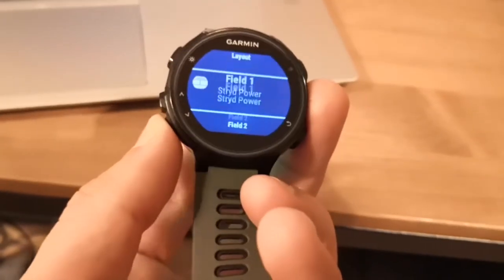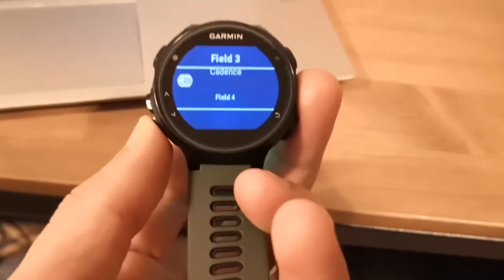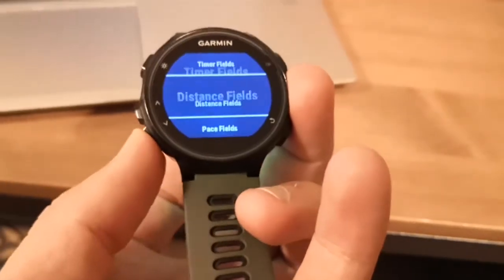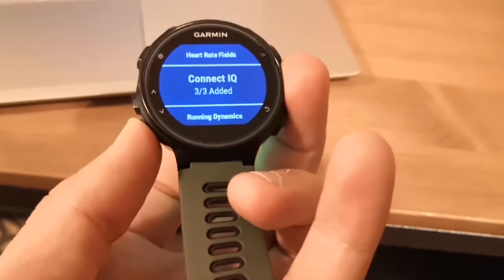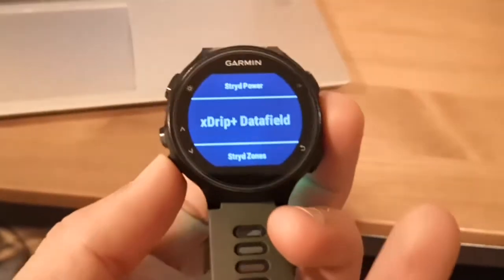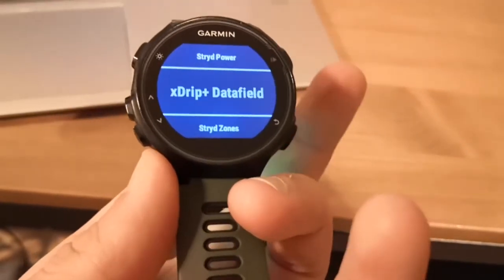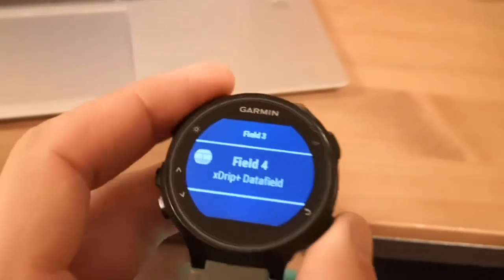You'll want to make sure you've selected that app. In this instance it's field four, the extra data field. Select field four, then keep scrolling down until you find Connect IQ — that's what you want. It's not listed under the name of the app; the app name is inside the Connect IQ section, which is the extra data field. Select the extra data field and it will show in field four of screen two.